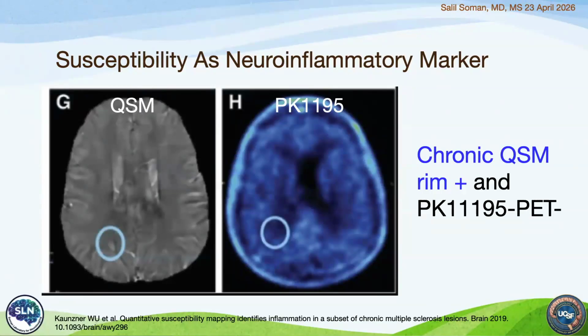My hope is working with you. We've got these sequences all set up on the PET/MR also. This sort of thing, getting into the realm of neuroinflammation, trying to evaluate infection or low-grade things, the stuff that we can't see on regular imaging. For neuro, this is what I tell my trainees: I love lots of things in neuro, but the frontier of new generation tracers along with advanced neuroimaging is, to me, a super exciting future that we can potentially have in neuro.